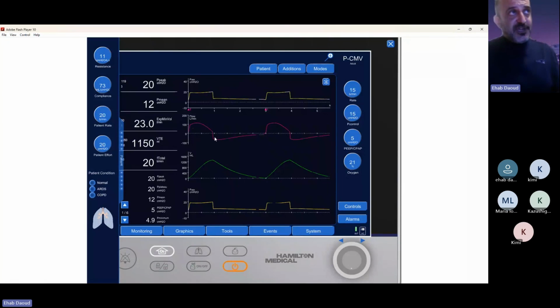But if you look here, now we matched exactly. The convexity starts to happen and almost stops at the exact same time that the ventilator cycles from inhalation to exhalation. So you actually got it pretty good here. So we talked about work shifting, early cycle, and delayed cycle.